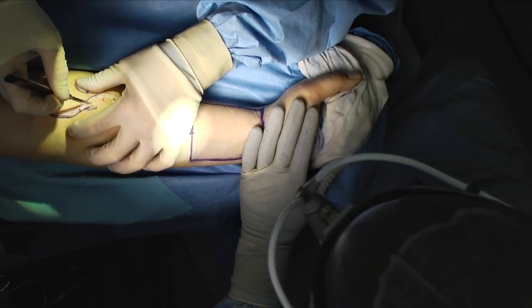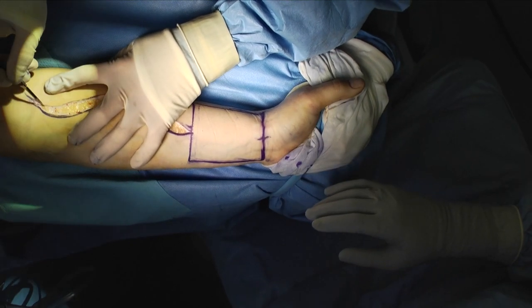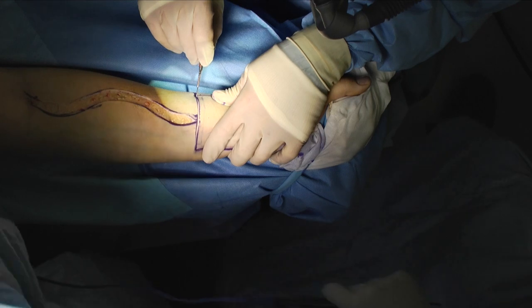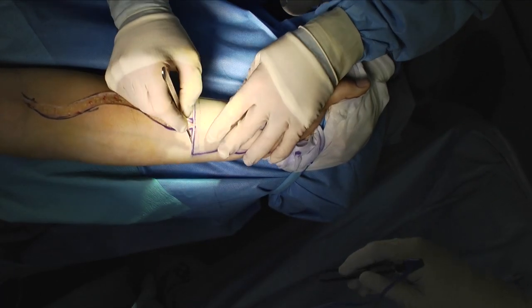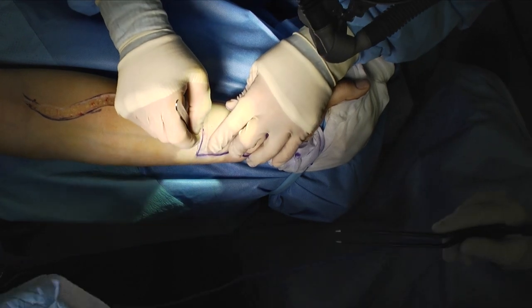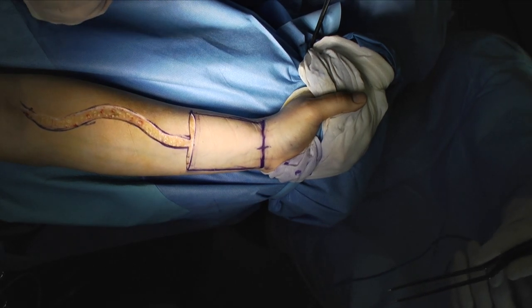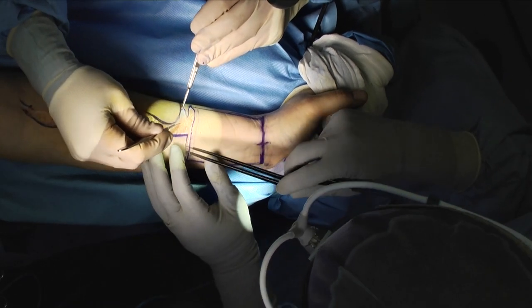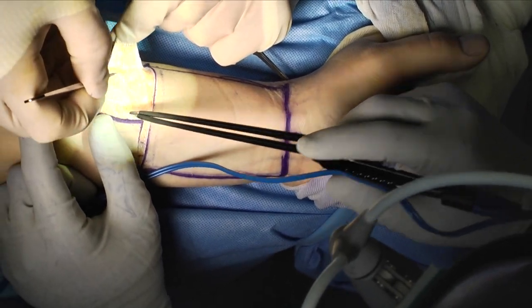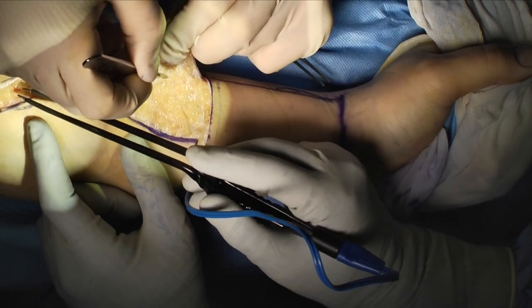We take special care not to go down aggressively through the fat as that might damage the cephalic vein as it lies just underneath the skin, particularly in thin individuals. Our next step is to incise the proximal portion of the skin paddle, conjoining it with our curvilinear incision. The skin is then grasped with Gerald's forceps with teeth and elevated on both sides of the curvilinear incision. A small bit of fat should be present on the underside of the skin as it's elevated so as not to damage the subdermal plexus.